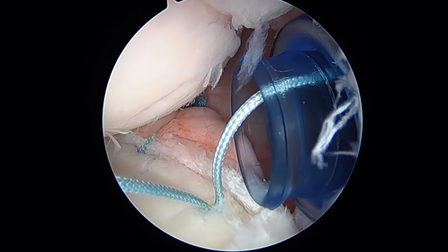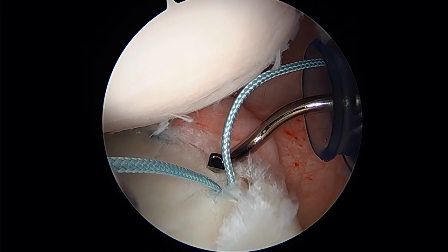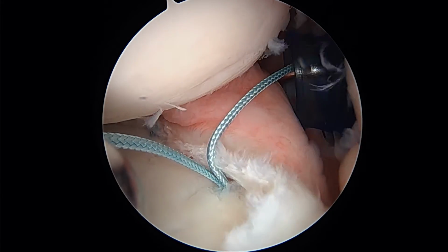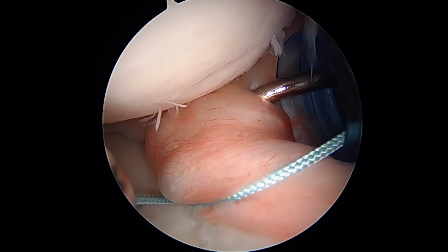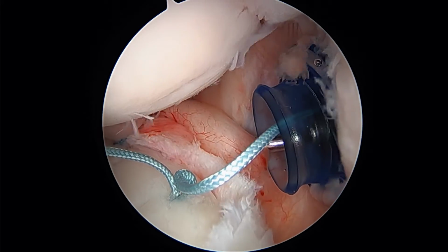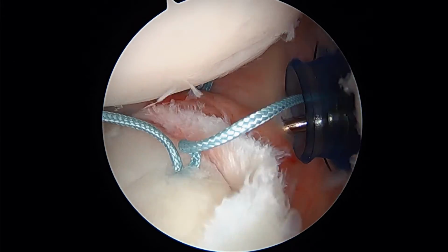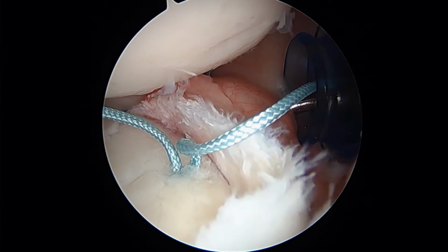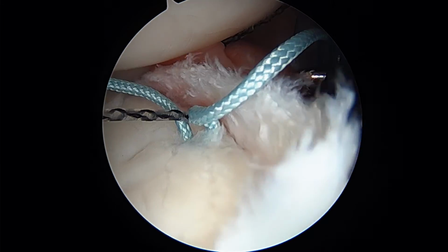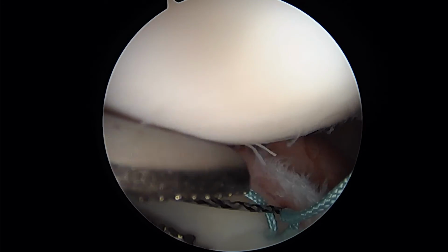We're going to take our suture hook, hold the camera here. We're going to rehearse our stitch. We'd like to end up there, which means going into the capsule right about here. And then as best we can, we're going to come underneath that labrum like that. Thank you. Then we'll reach in the front and retrieve it like we showed you before, just like that. So we'll go off on the video, show you some more in a minute.